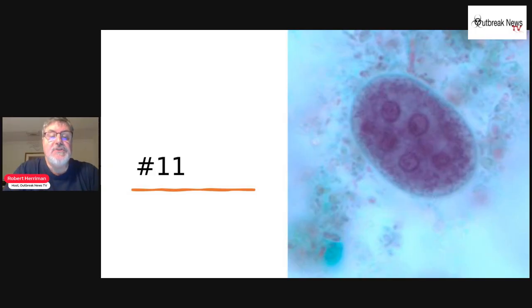Now, this stage of the parasite is usually spherical, but may be elongated and measure 10 to 35 microns. Mature forms of the stage typically have 8 nuclei, but can have as many as 16 or more. The nucleus, karyosomes are usually eccentrically located. Peripheral chromatin is present and often coarse, granular, and irregular in appearance. The cytoplasm may contain diffuse glycogen. Chromatoid bodies, if present, are usually splinter-like with pointed ends. All right, what do you think?